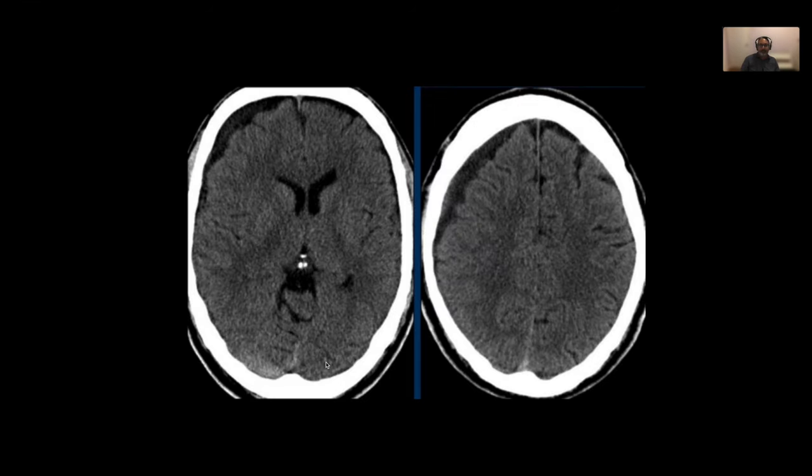Okay, so this is for you. So where's the bleeding? There's the bleeding. This is a subdural, absolutely. So because subdural is a venous bleed, it doesn't have as much of a mass effect. Extradural is an arterial bleed. So this is absolutely subdural. And you see, it doesn't have that much of a mass effect. And subdural can also be chronic. You know, like football players get it. Chronic head injuries, they get it. And common in elderly also. So that's a subdural hemorrhage. Excellent. So that's good.